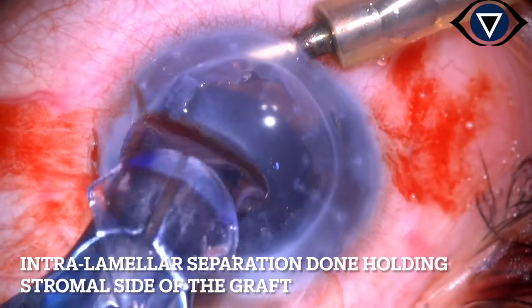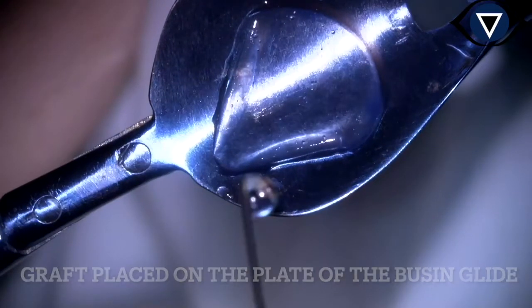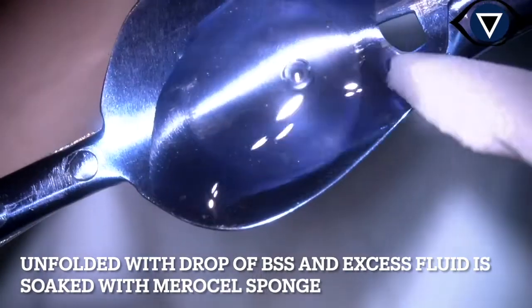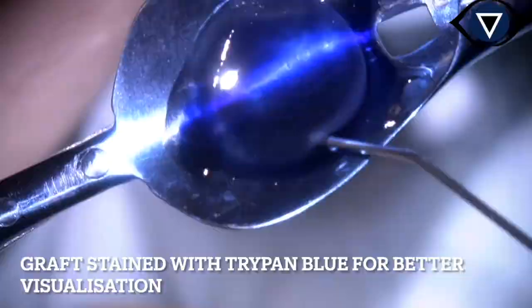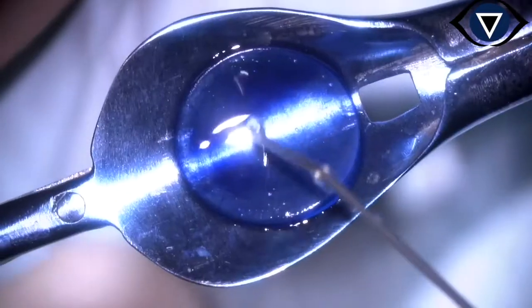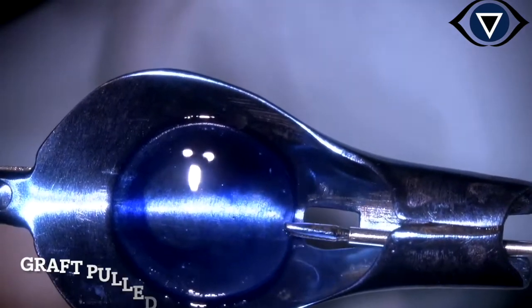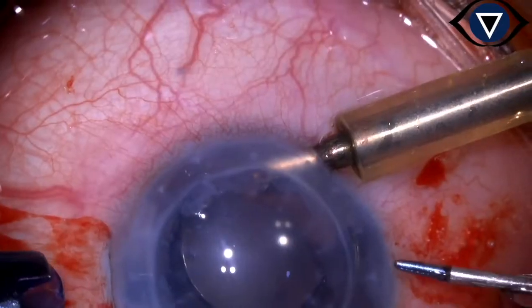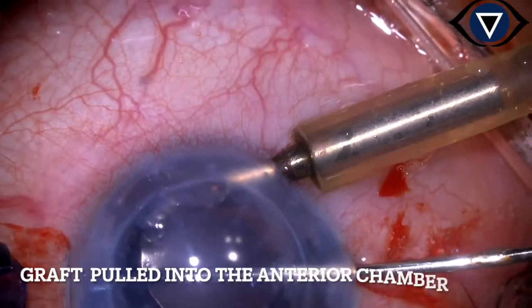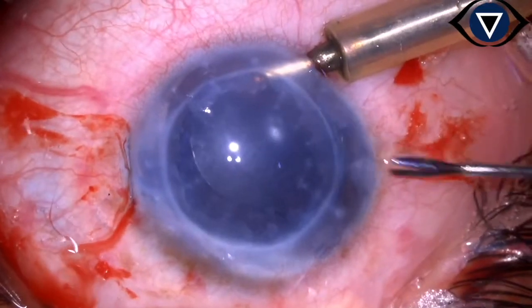This lenticule was then implanted in a patient of post-penetrating keratoplasty graft edema, where the surgery was performed like a normal DSEK surgery. As we have seen in the course of this video, this particular lenticule had been exposed to femtosecond laser, excimer laser and also applanation while the inlay was being harvested on the femtosecond machine. But as we will see, this patient after surgery has been doing well.